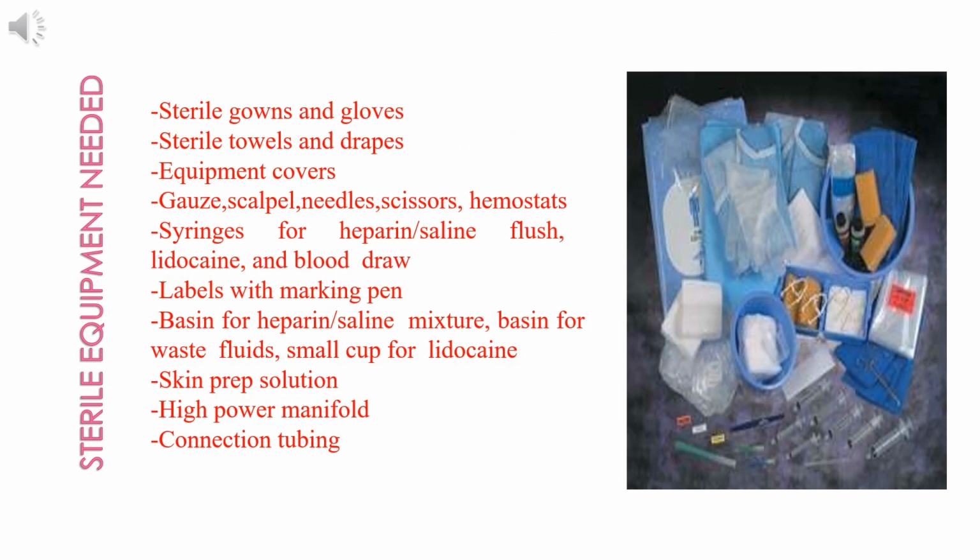What are the sterile equipment needed during cardiac catheterization?